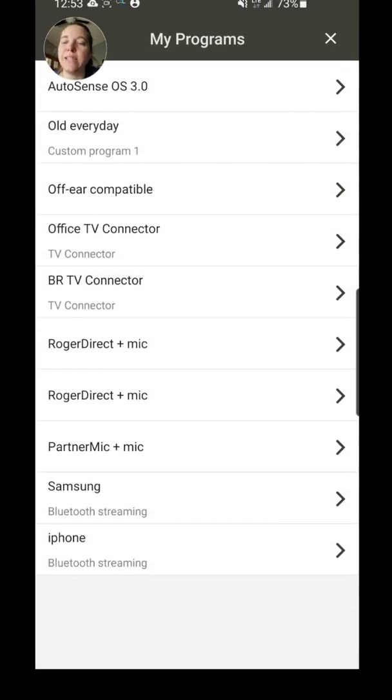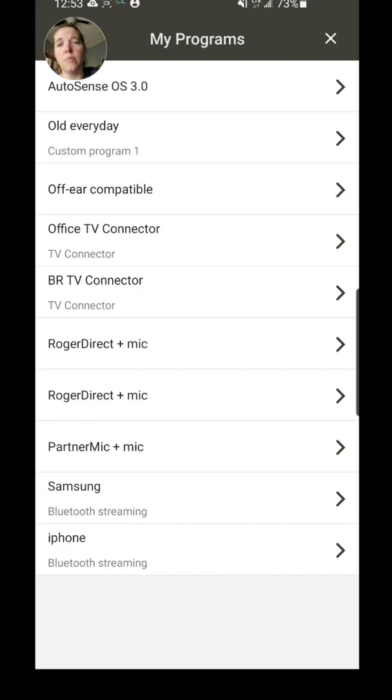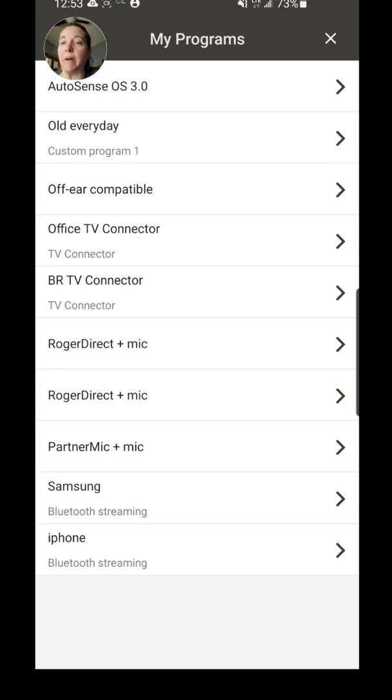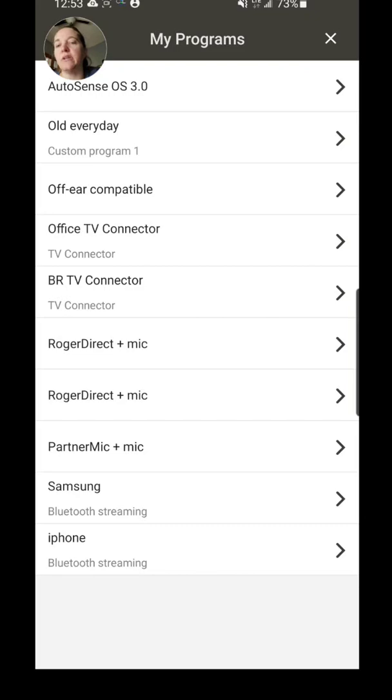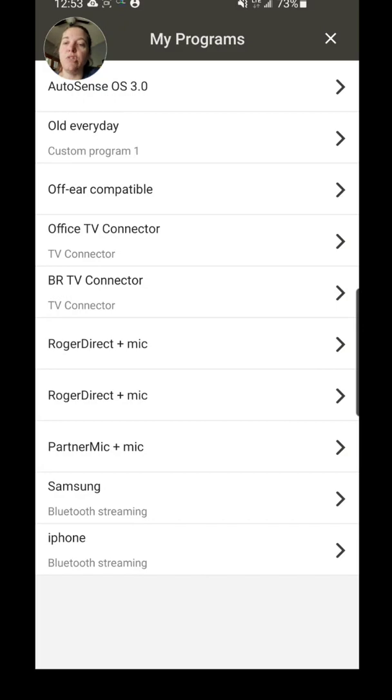So under My Devices, you'll have My Programs. This is a list of programs that are available—they may not all be accessible at the moment. You'll see any program that is added by your audiologist will be up at the top, but then you also see TV Connector, Roger Direct, Plus Mic, Partner Mic, and then Bluetooth Streaming.